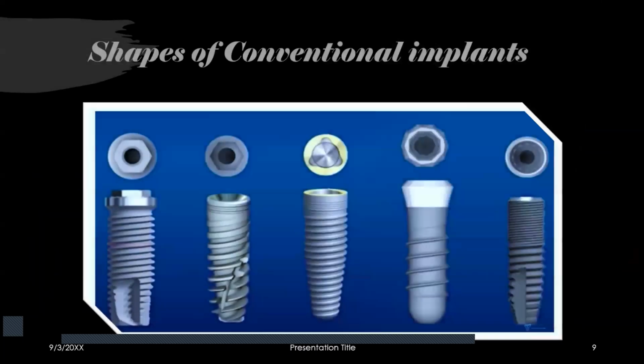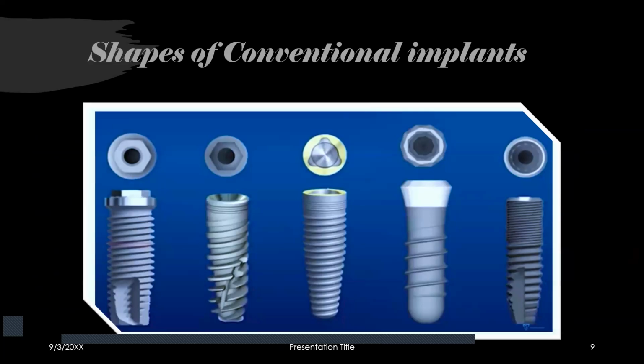But for me, what is the biggest trouble? Why do I prefer cortical implants nowadays, and why have I shifted exclusively from conventional to corticobasal implantology? One of the biggest reasons is that when a patient comes to me with a lower or upper bone that is, say, 3 millimeters in width, a thin knife-edge ridge is possible. All the implants available to me, from any company, are cylindrical in shape, and it is not possible to place these wide implants into that narrow bone of only 3 or 3.5 millimeters. So what happens in that situation?